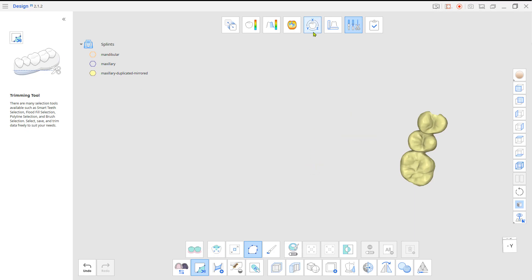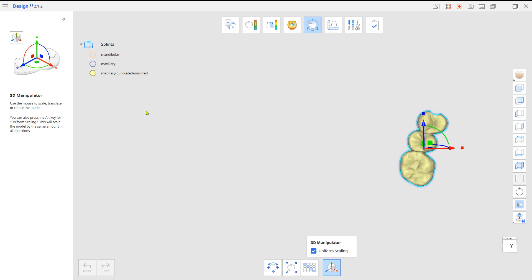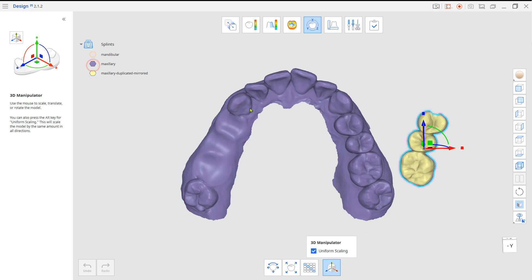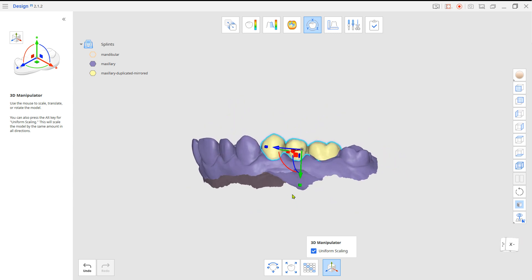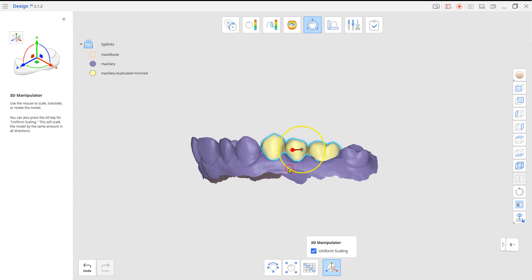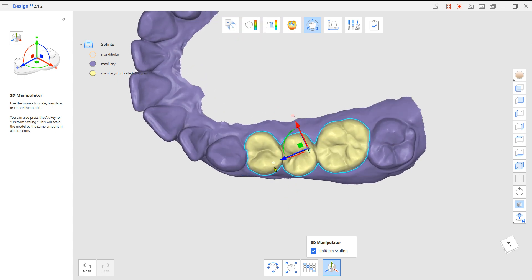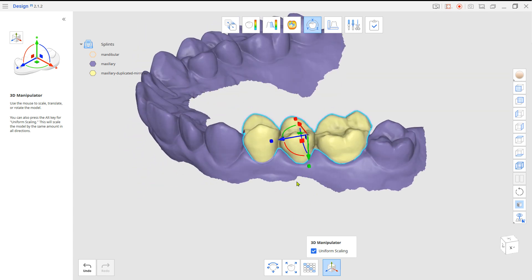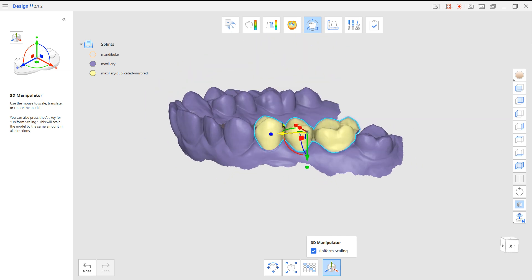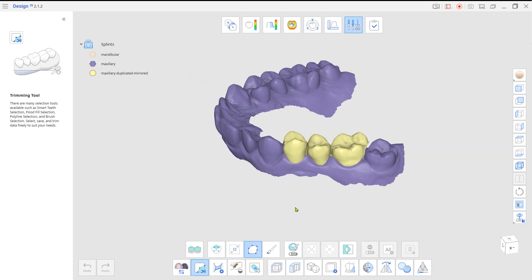Go to Transformation Mode and mirror the duplicated bridge. Then go back to Edit Mode and use Combine to merge them together.